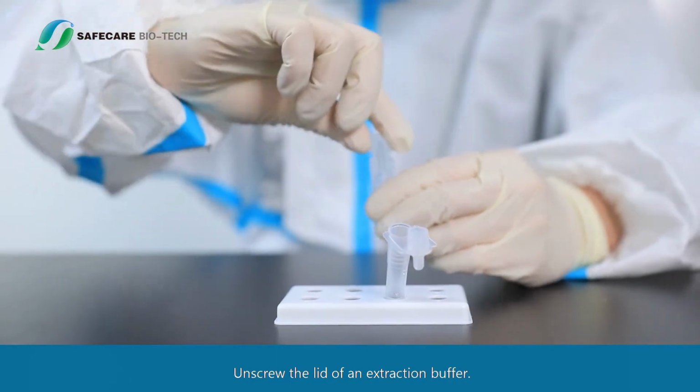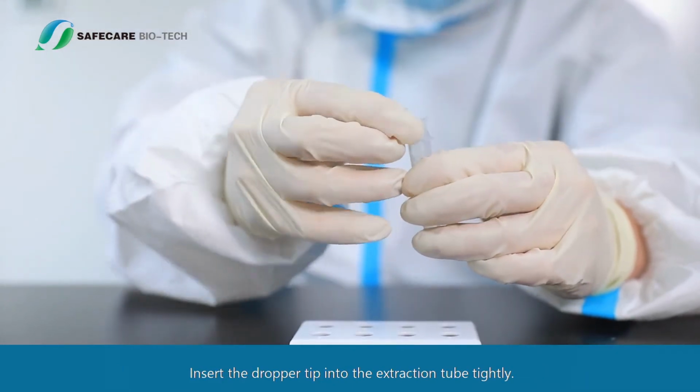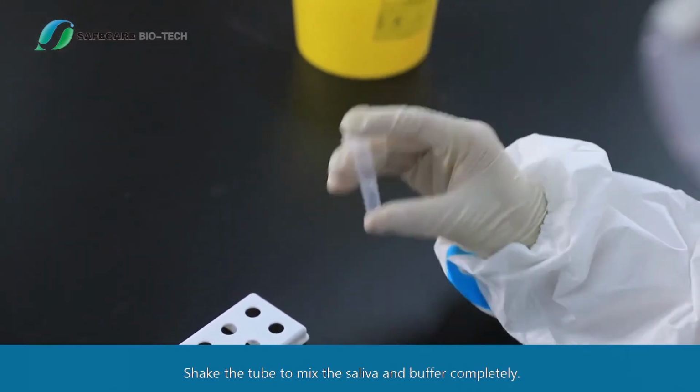Test procedure. Unscrew the lid of an extraction buffer. Squeeze the extraction buffer and add all the buffer into the extraction tube. Insert the dropper tip into the extraction tube tightly. Shake the tube to mix the saliva and buffer completely.